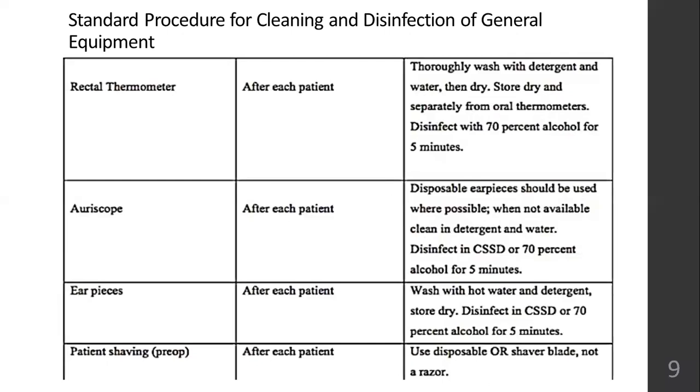Rectal thermometer, after each patient, it has to be thoroughly washed with detergent. Okay, and the rectal thermometer is stored separately from the oral thermometer. You should not mix it up. Okay, it has to be disinfected with 70% alcohol for 5 minutes.